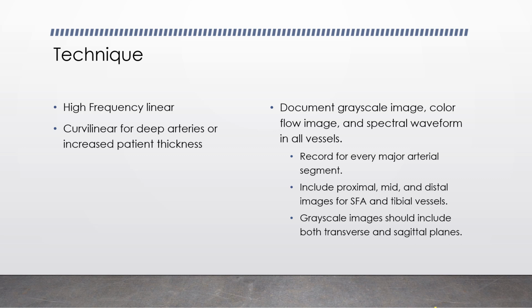When we begin this exam, we're going to really start out with our grayscale imaging. We're going to image in grayscale in long and transverse, looking for the patency or the opening of the vessel. Make sure that you're ready to adjust your dynamic range and your gain, your TGC, things like that to optimize your visualization of the vessel wall.